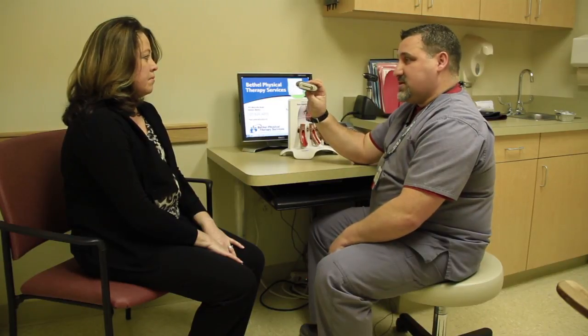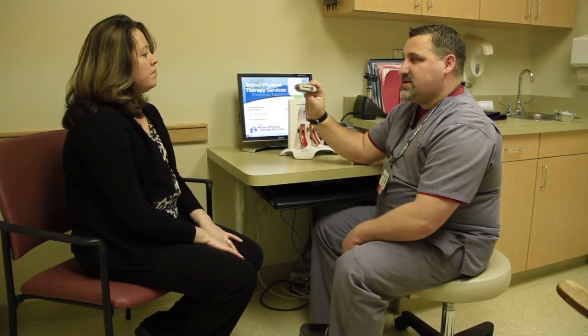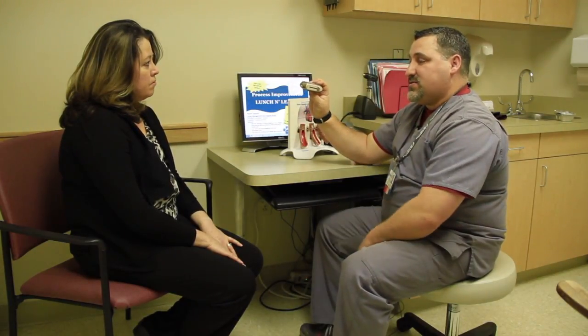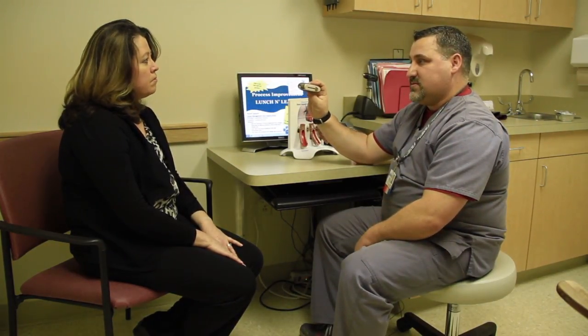Some of the inhalers that you will use will require you to rinse your mouth out. Some of them have a steroid, and if that's the case when you're done, you do want to rinse your mouth out with water really well.